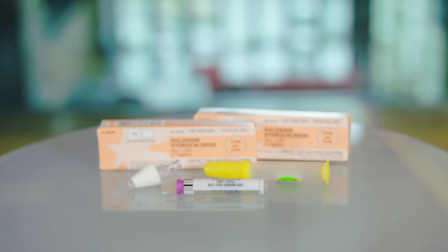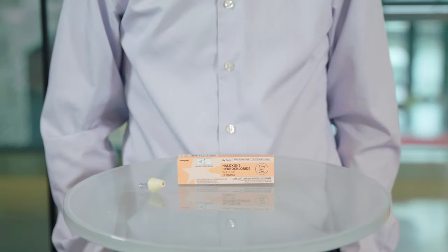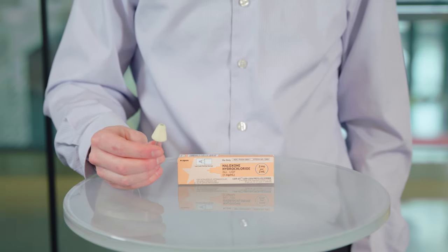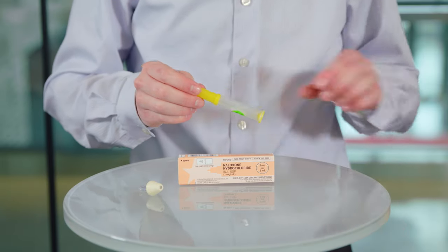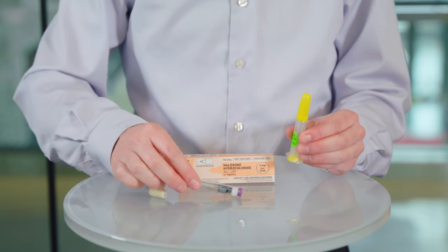Now, let's discuss how to use naloxone. The intranasal naloxone kit comes with a device called a nasal atomizer that helps to deliver drug to the nose, and a box like this. In the box, you'll find two pieces: the syringe and a medication vial. Each box contains one pre-filled dose.